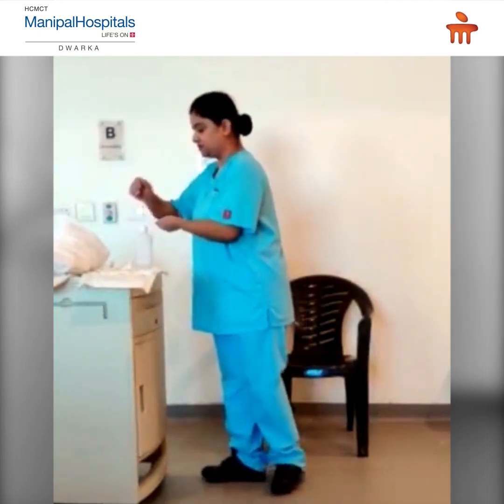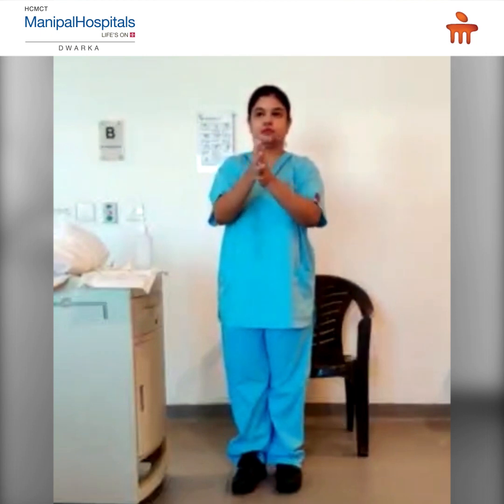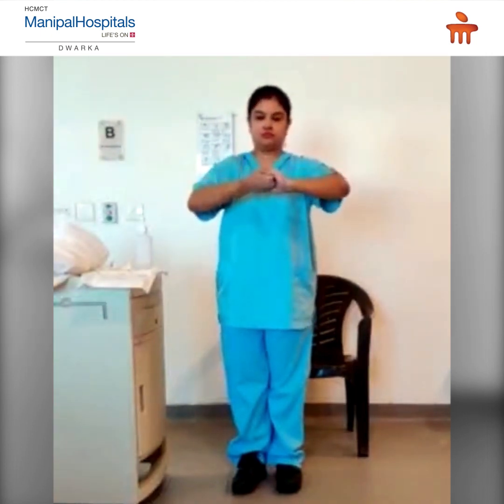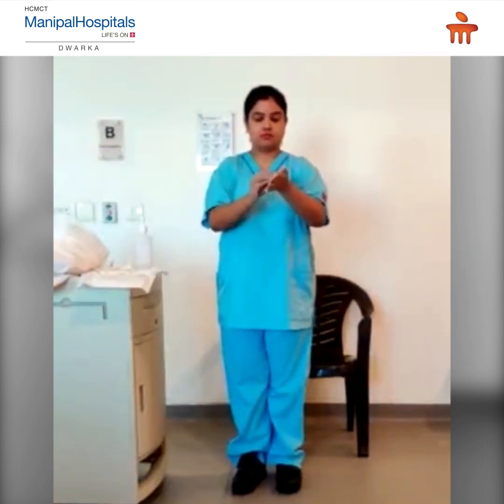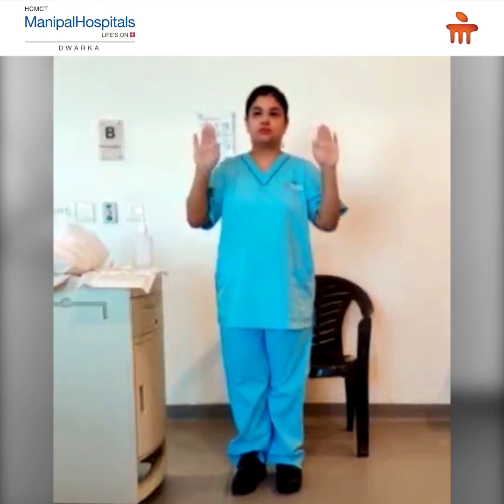First, perform hand hygiene. Now wear your first pair of gloves.